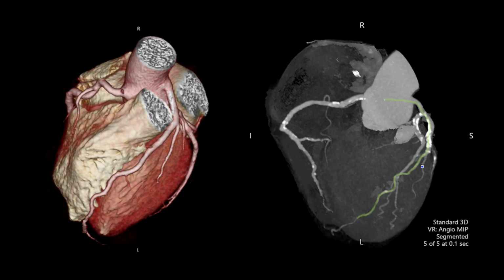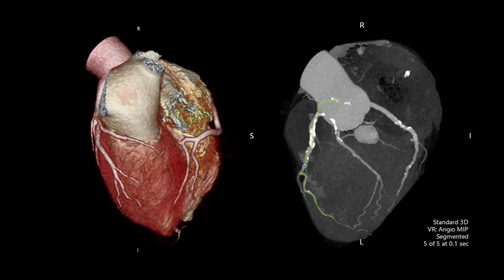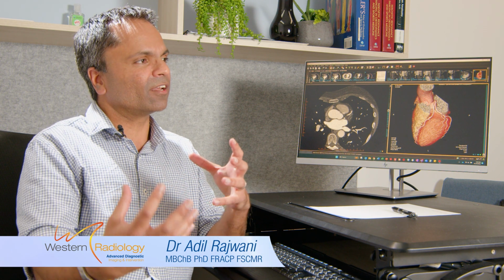So the key information that the CTCA will give to your doctor if you're having chest pain is whether there are detectable narrowings that could be causing that interruption of blood supply that can cause chest pain on exertion. But it also goes one step further. It gives a lot more information, not just about significant narrowings, but also other narrowings which are in the process of development. And we really understand now that it's not just the amount of blockage of a single narrowing, it's about how much plaque there is in the entire coronary tree.